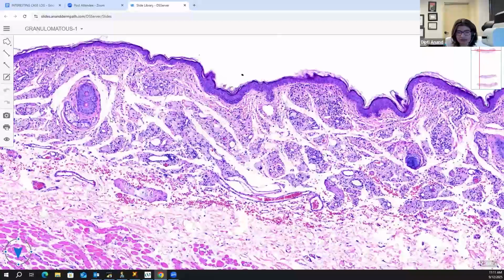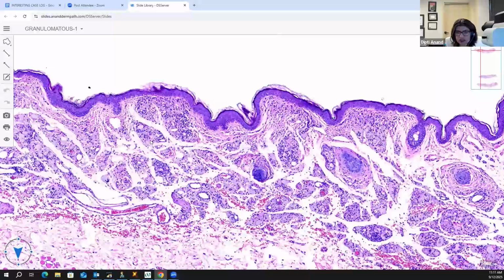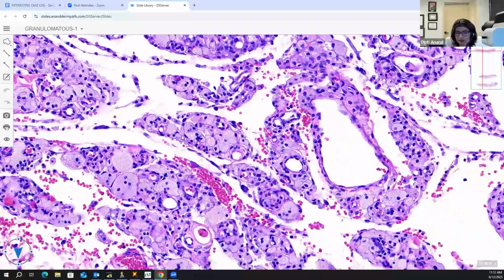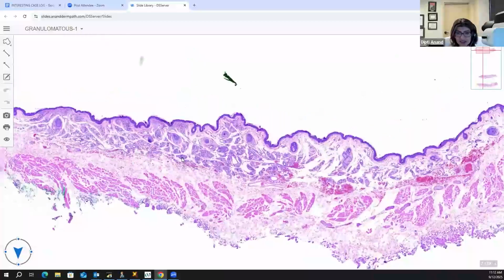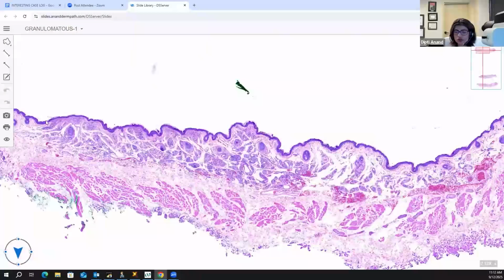But also the thin epidermis and the numerous tiny vellus hair follicles. And then you have these foamy xanthomatized histiocytes. And for xanthelasma, recognition of the skin as the eyelid skin is also really important.